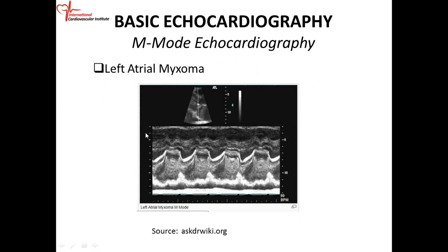Okay, so you're also going to get this. They like it for whatever reason. Okay, so again, same work from first principles, two-dimensional echo on top, cursor is right there, cursor is crossing these structures.